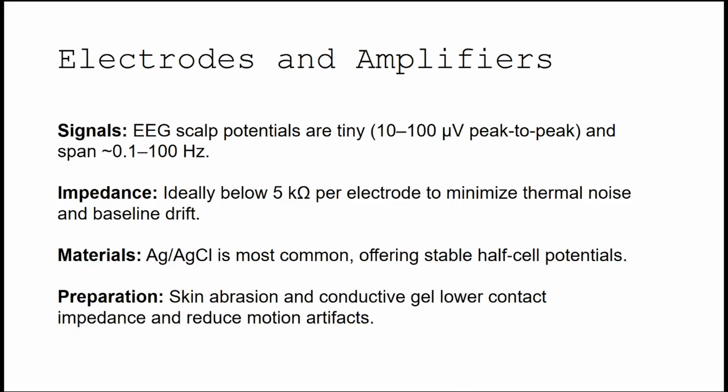Again, the signals that the EEG is measuring are very tiny. They are in the range of microvolts. Now go back to the ECG. If you are a physician, the ECG, the activity produced by the heart, is normally in the range of millivolts. So this is three orders of magnitude. This means the signal that comes from the heart is much larger than the signals that come from the brain, and this is why we need to amplify it.